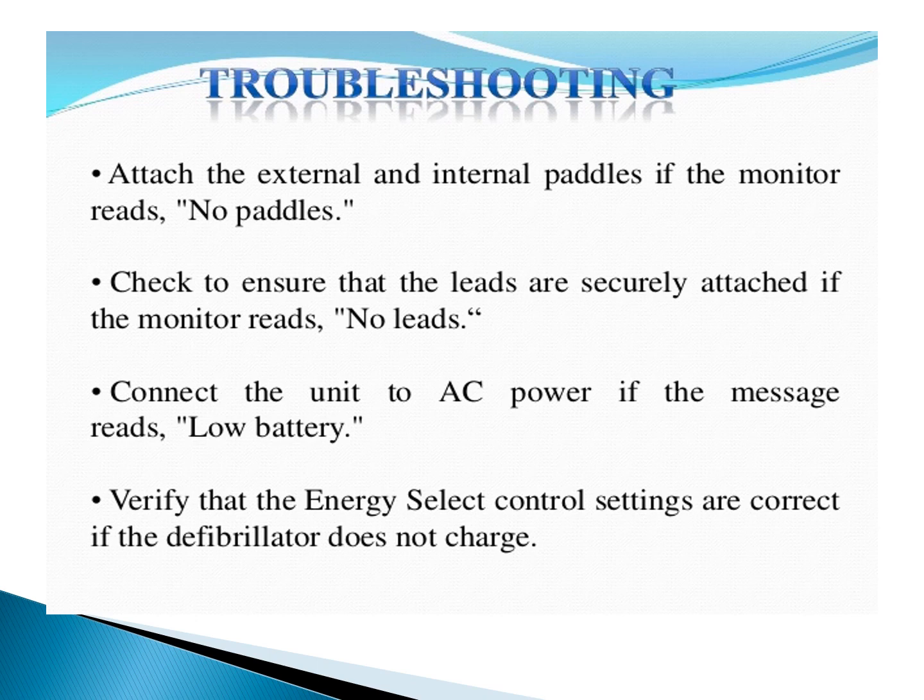So what is troubleshooting? Attach the internal and external paddles. If the monitor reads no paddles, check to ensure this. If it shows a problem, it means the charge is not being delivered to the patient's body. So you have to ensure the paddle is placed on the patient's body correctly, whether the leads are attached, the AC power is on, whether the defibrillator has adequate charge, or whether the battery is working, and you have to select the energy and the control settings. Everything you have to check before delivering the shock.